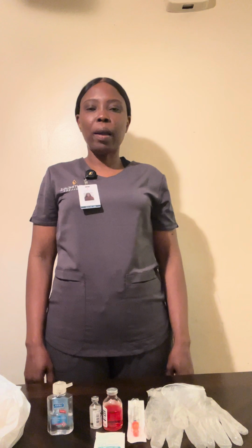Today I'm going to demonstrate drawing up insulin. This is my school ID. This is my uniform. This is all my equipment. First, I'm going to check my physician order. I'm going to check the six rights of medication: right patient, right drug, right dose, right time, right route, and right documentation. Now I'm going to pull up my patient's EHR, check the order, and check the medication against the order.